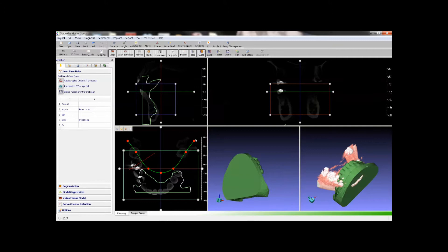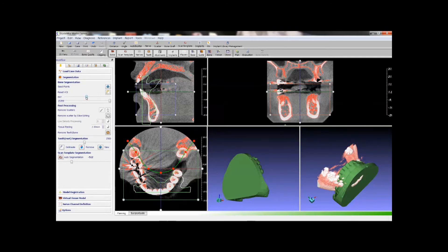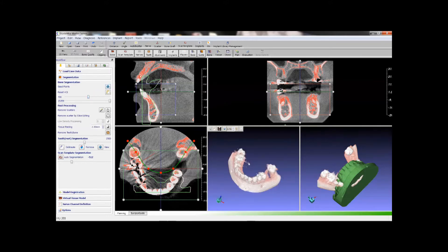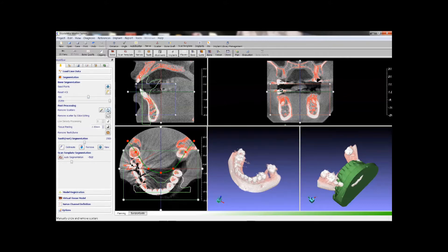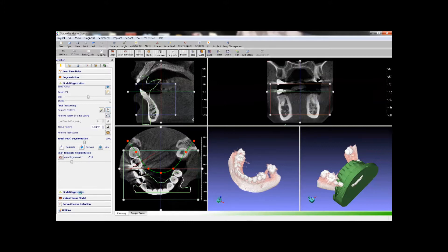Before we align the model with CT scan we will do a bone segmentation. We can adjust region of interest first, or go ahead adjust the thresholds. Notice the white and red areas in the 2D views are the bone and teeth. Here are some x-ray scatters. We have both automatic and manual scatter removal tools, but for this case it is not necessary.